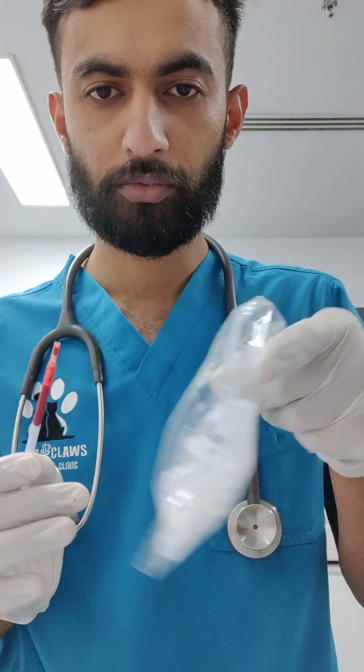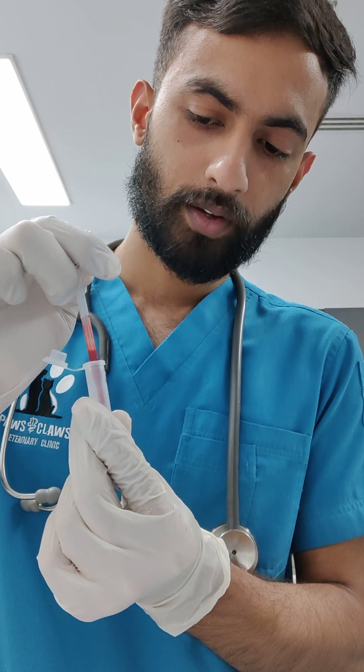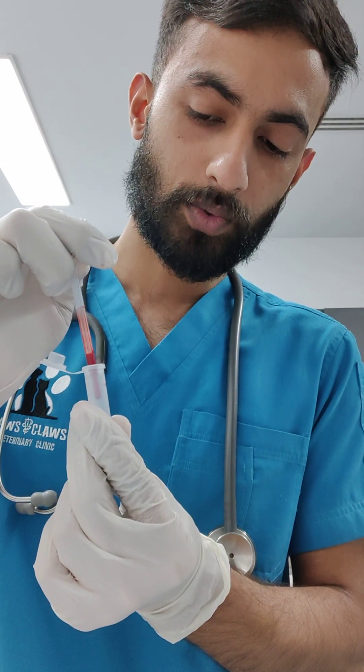The next step — we have this type of pipette inside the IDEX box. You can take one pipette from here. After taking the pipette, you can put the blood drops, but just try to make sure it is not touching the wall. So 3 drops of the blood: 1, 2, and 3.